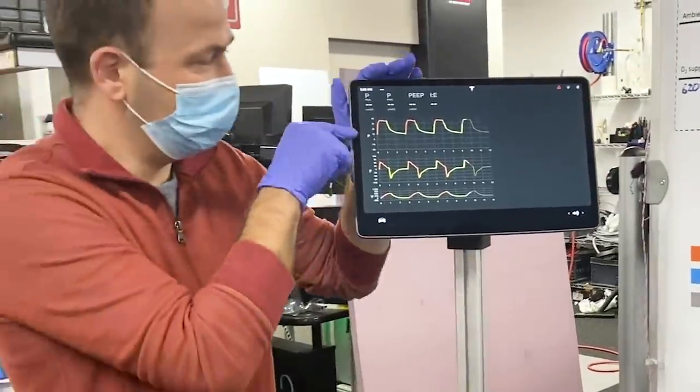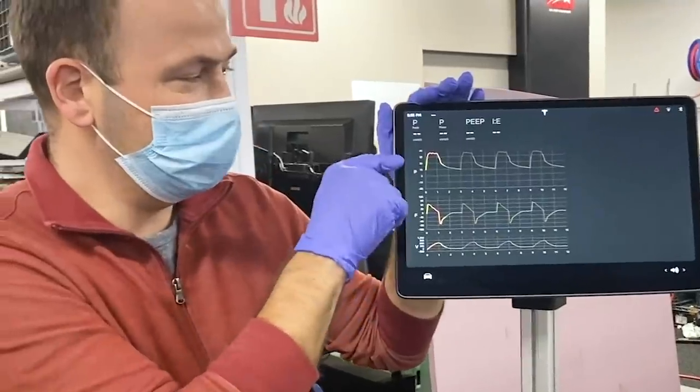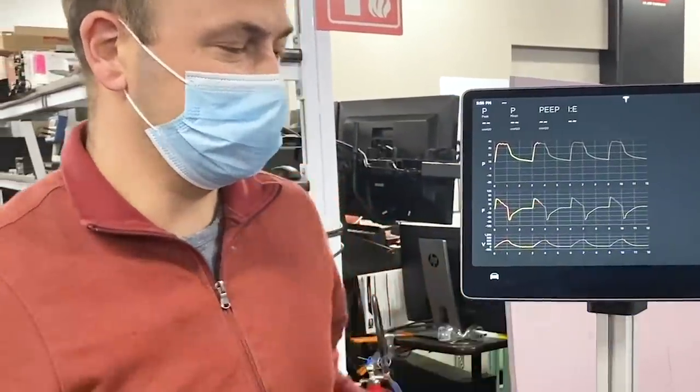That breath is actually being plotted out up here. We have three plots for pressure, flow, and volume. And you can see the line moving across as the lung is breathing.